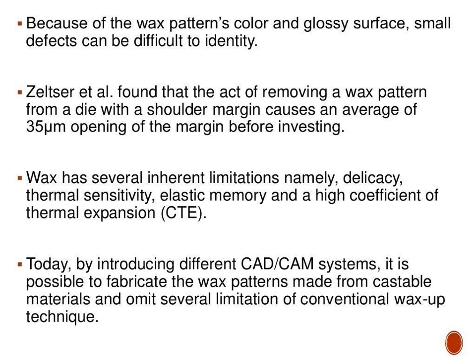Wax has several inherent limitations, namely delicacy, thermal sensitivity, elastic memory, and a high coefficient of thermal expansion. Today, by introducing different CAD/CAM systems, it is possible to fabricate the wax patterns made from castable materials and omit several limitations of the conventional wax-up technique.